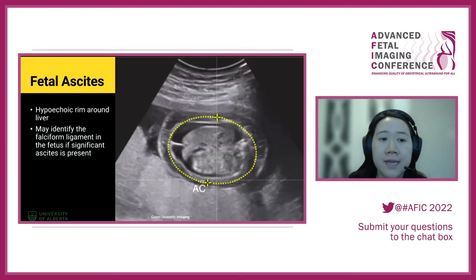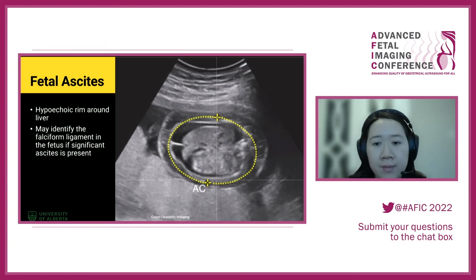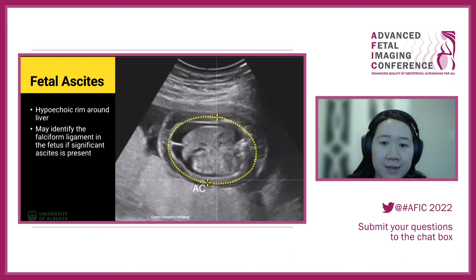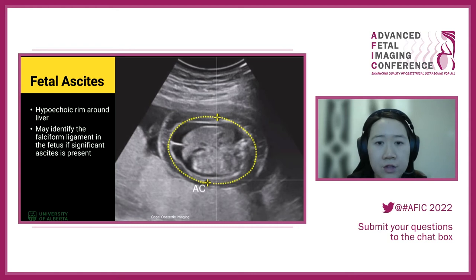With fetal ascites, we're looking for a hypoechoic rim within the abdomen, specifically around the liver. In this transverse view — an attempt at an abdominal circumference — there is so much fluid that we can actually see the fetal liver and the falciform ligament. Another clue is that the skin is also thickened in this image.